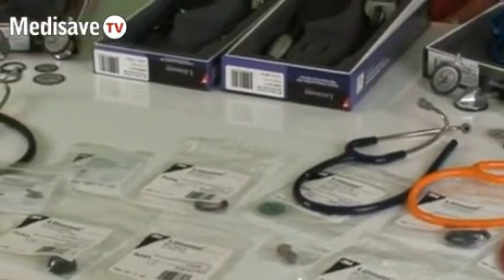There is no doubt that the Littman range of stethoscopes is built to last and comes with very generous warranties. However, even after the warranty has expired, it is possible to replace all the individual parts on a Littman.